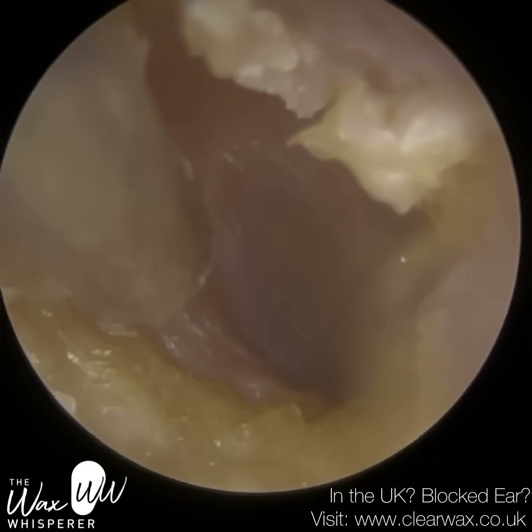I've managed to get the forceps underneath — I'm lifting it up and away. The ear canal narrows here a little bit. You can see that bottom jaw is quite close to the front wall of the canal. With the wax scope stretching the ear open, it allows more freedom with the instrument. Even though I'm stretching the ear canal with the endoscope, it still has to come in from a slight angle — from the top right down to the centre — and then the forceps have to be repositioned back to the right, because the ear canal straightens that way.